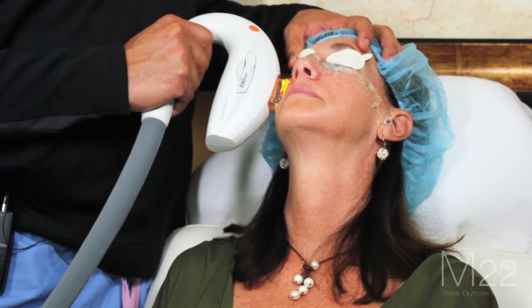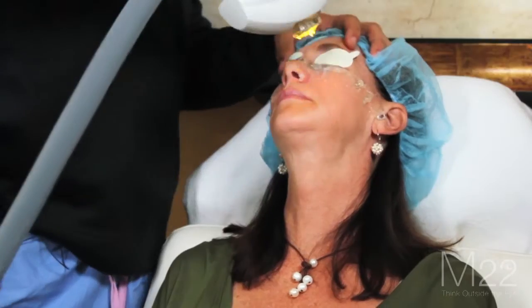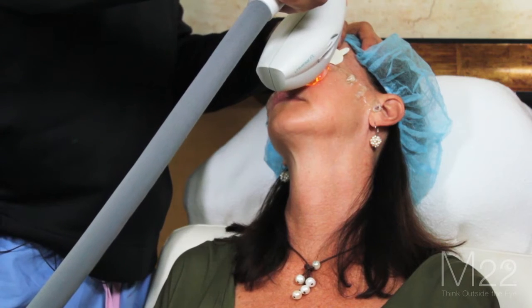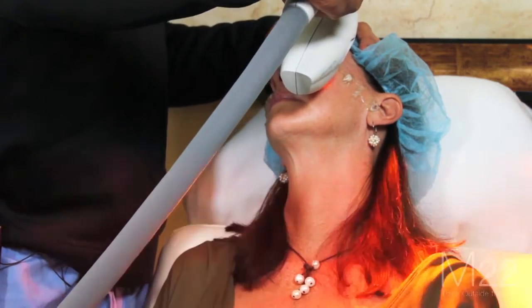If you just treat the cheek area and don't get close to the lid margin, you will get some results, but you won't get the full effect. In our clinic we have over a 95% success rate.